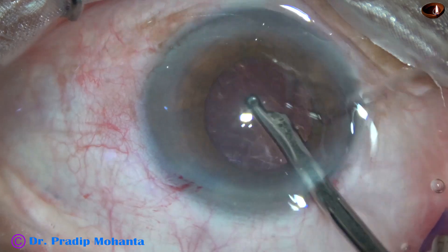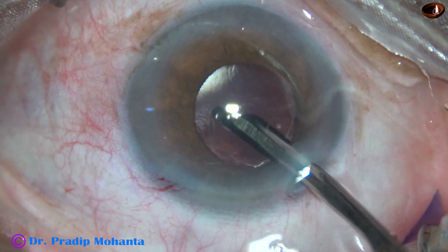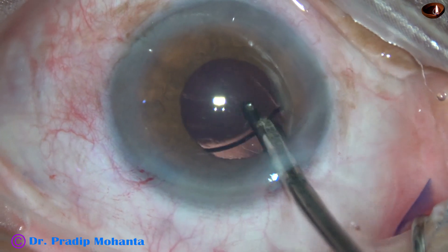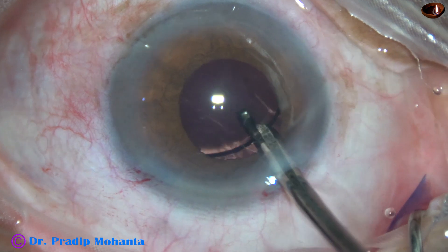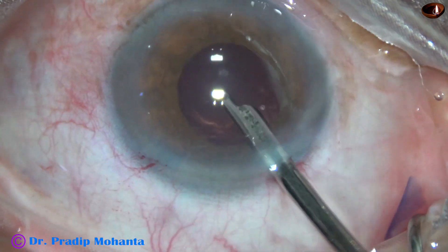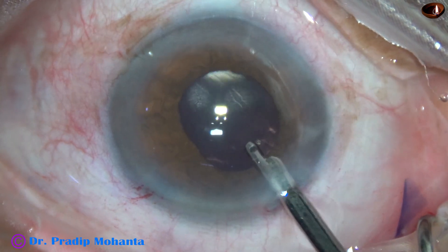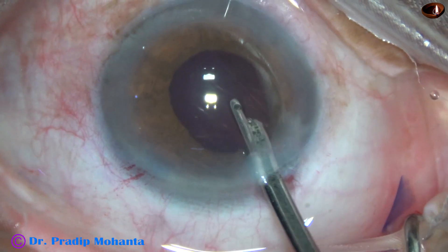I am dedicating about 3 minutes to removing the viscoelastic thoroughly, because I don't want any raised intraocular pressure in the post-operative period. I am using the Simcoe cannula first to irrigate the anterior chamber and capsular bag and aspirate viscoelastic, then I will use bimanual irrigation-aspiration for some time.